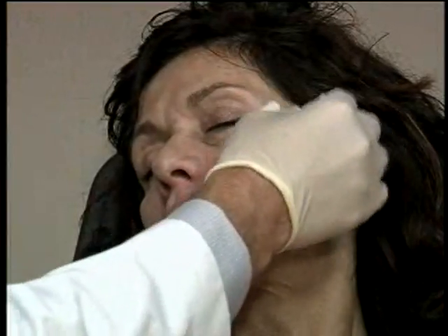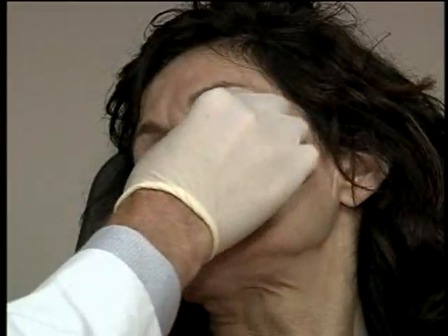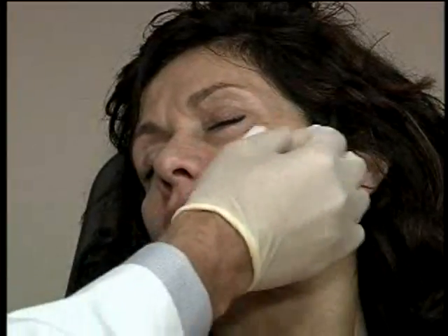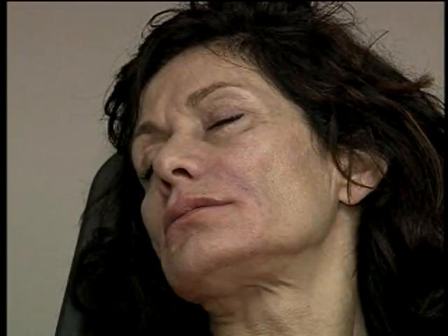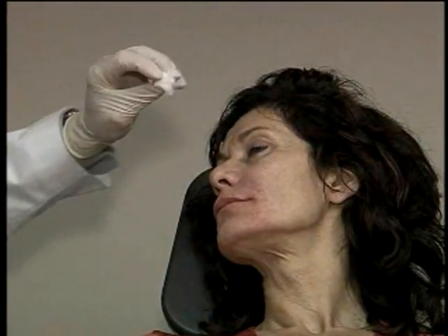I like makeup pencil because it comes off much easier than a marking pen. So if a patient wants to show me something, we'll give them a makeup pencil. And that's a way for them to show me where they want to be treated. And I can also demonstrate to them where I think they should be treated. So my assistant usually helps me here.